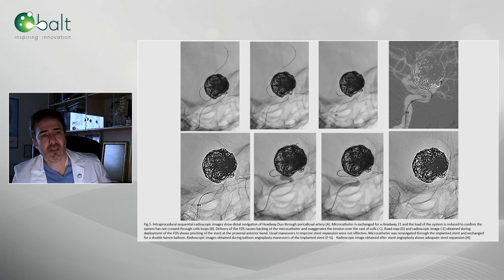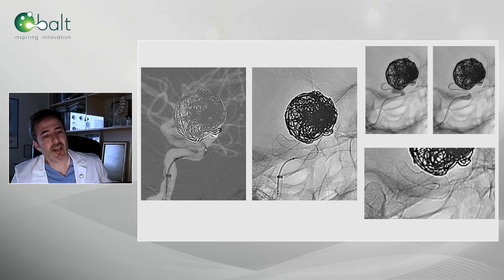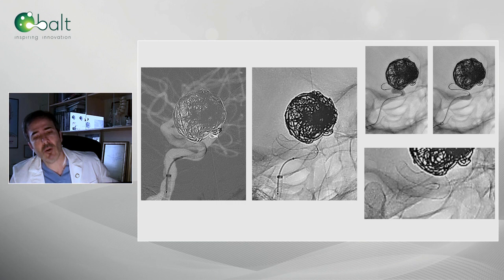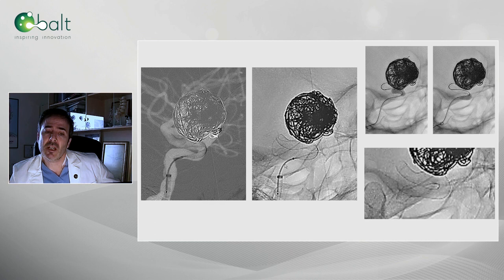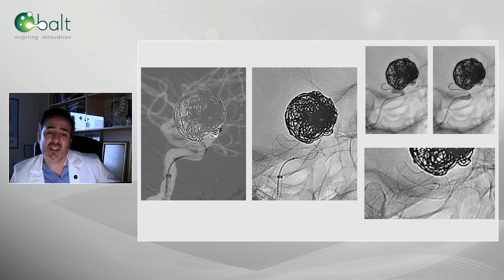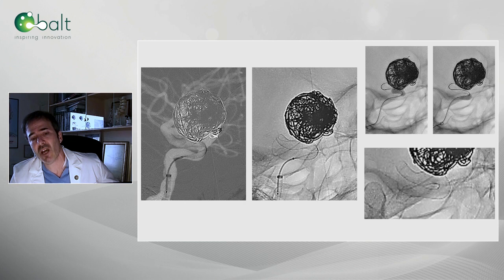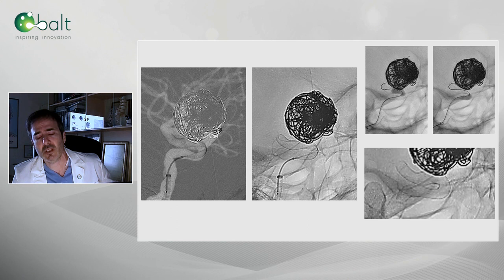This is the navigation, and this is the implant of the flow diverter. I started to deploy the flow diverter, and then I saw this pinching of the flow diverter. I played with the regular maneuvers, and again I remained with this stenosis. I didn't know how to deal with it. I played a little bit with the system and realized I didn't have any other option rather than to deliver the device completely. Using the same guide wire of the device, I recrossed with a 21 — and this is one of the good things of this system: you can recross with a relatively small catheter.